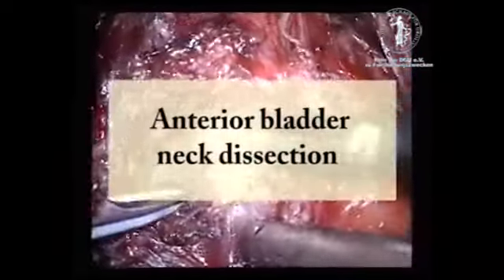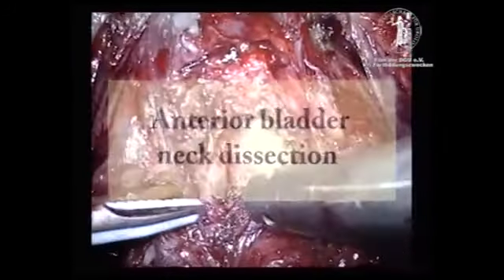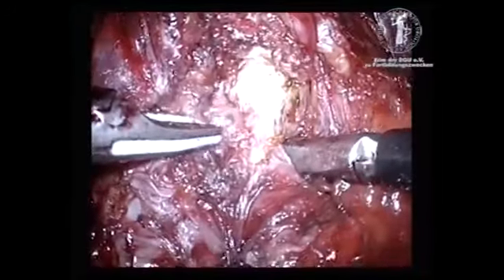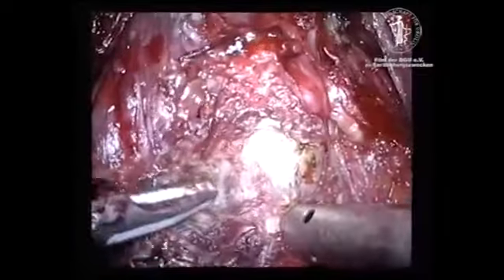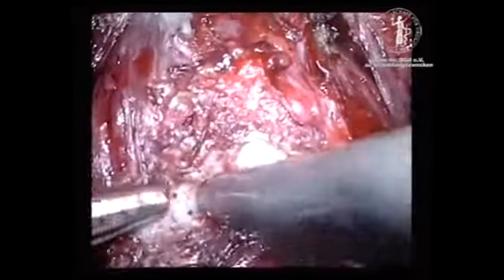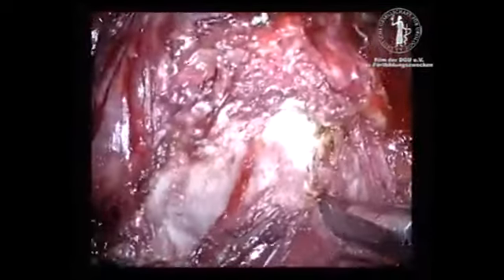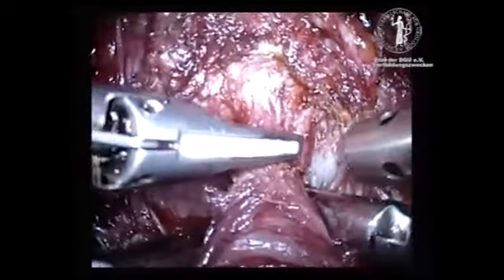The next step is the bladder neck dissection. It is performed as a mixture of blunt and sharp dissection using the sonosurge device to minimize blood loss. The bladder neck dissection is commenced from the 10 to 2 o'clock position. This allows the identification of the longitudinal muscle fibers of the bladder neck. In bladder neck sparing procedures, these longitudinal muscle fibers have to be carefully developed.